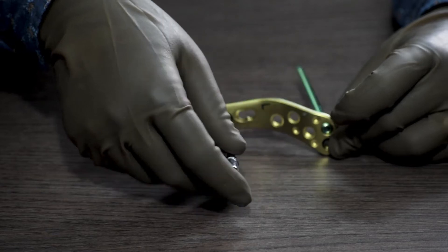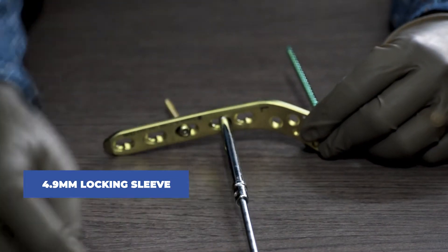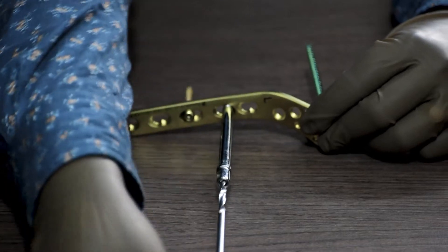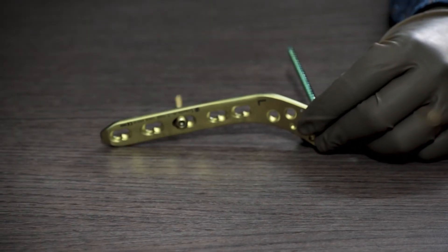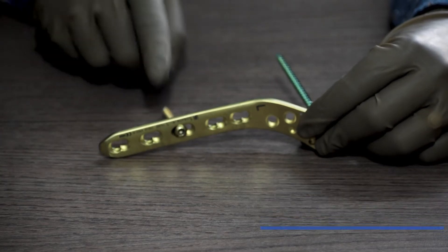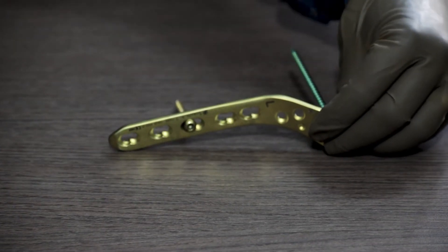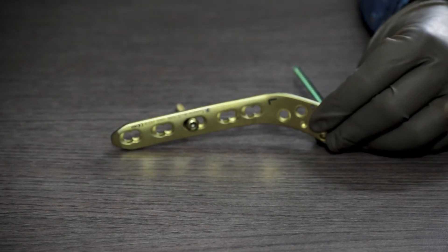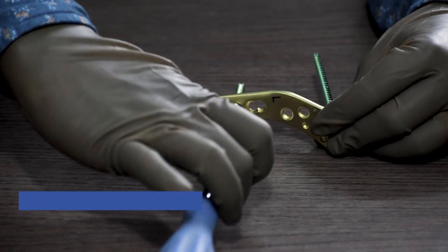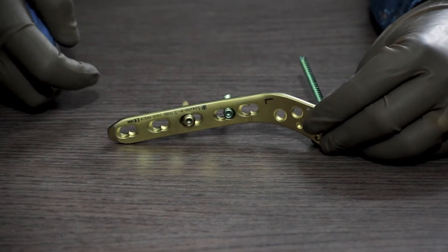The shaft region of the tibia is basically cortical, so we use cortical screws in the shaft region. To fix a locking cortical screw in the shaft region, we again use a 4.9mm locking sleeve and fix it in the locking hole of the plate in the shaft. We then drill through the locking sleeve with a 4.3mm drill bit. Once drilling is done, we either read the marking on the drill bit or use a depth gauge to measure the required screw length. We then take a 4.9mm locking cortical screw of the measured length and, with a 4.5mm solid screwdriver, lock it with the plate and the bone.